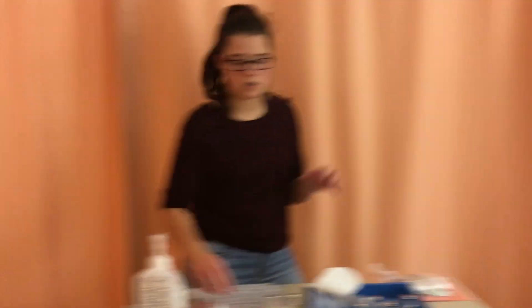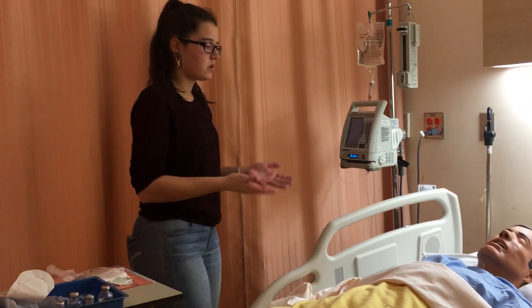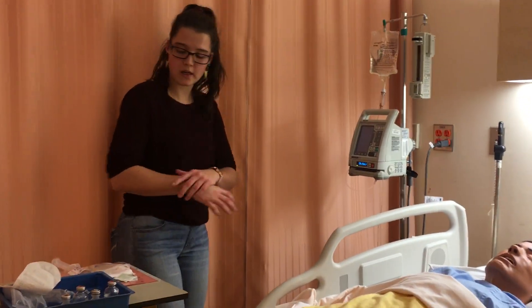As I walk into the patient's room, I'll knock and do hand hygiene. I'm going to do a quick safety check — my patient doesn't look like she's in any distress at all. The side rails are up, which is good.